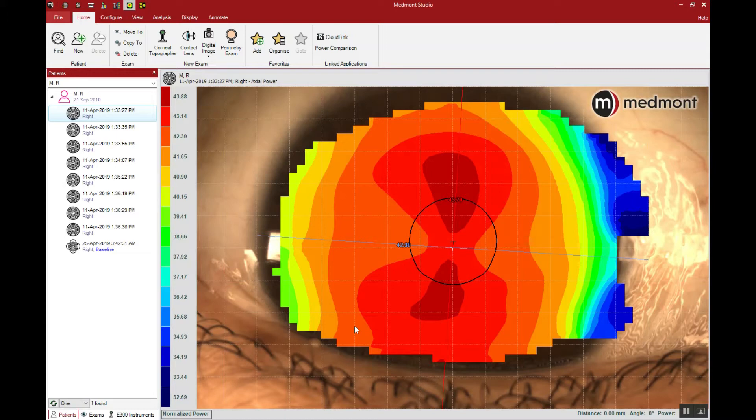One of the important considerations related to pre-fitting topography is that whenever we do a capture, we're always taking a photo of a moving target. The patient isn't 100% steady, and the tear film is always in flux, so one single topography is never enough. Always take multiple maps.